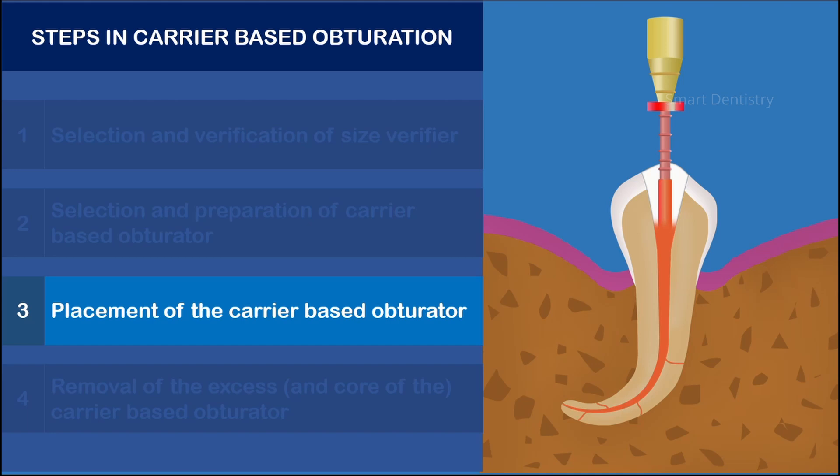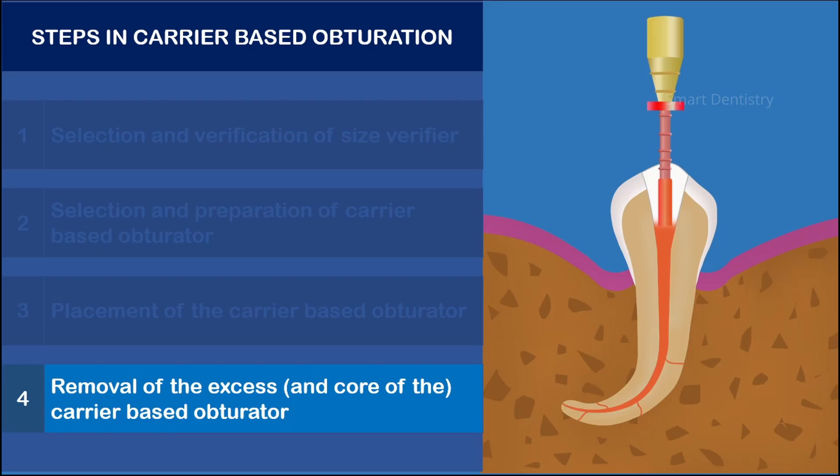Once the gutta-percha hardens, the handle can be tilted back and forth two or three times to separate the core. Excess material at the orifice level can, if needed, be packed with the help of a root canal plugger.